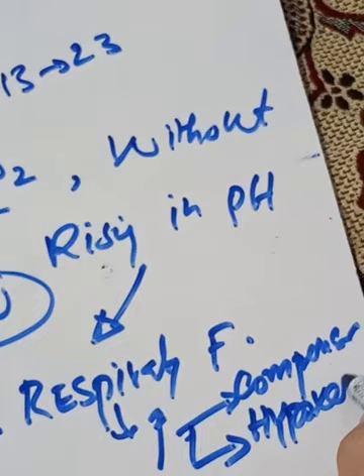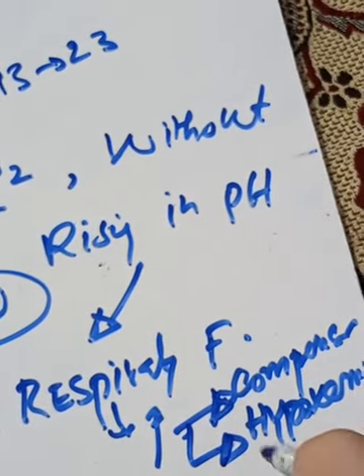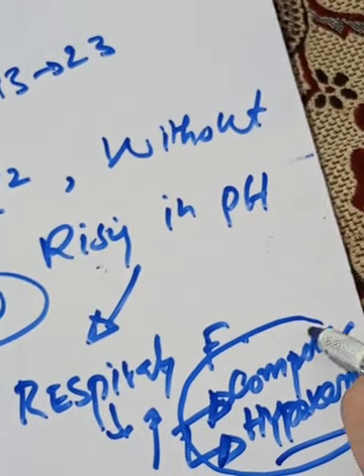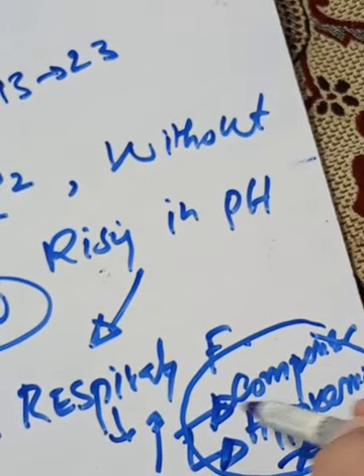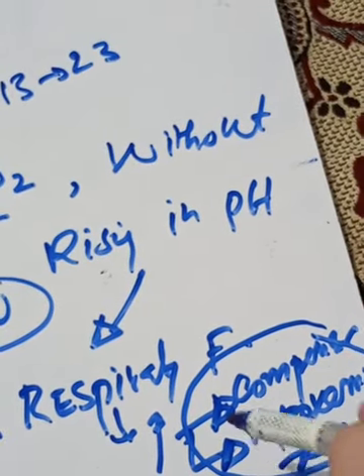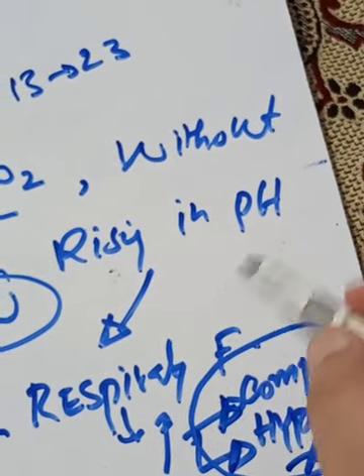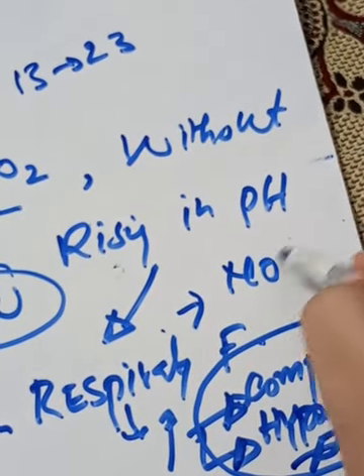To fight the hypoxemia, he will have to take in more oxygen. In order to take in more oxygen, he is washing out the CO2 more. So there is a double stimulus for this, and he also was having pain. So there are three things actually: compensation, hypoxemia, and pain. So this patient was a candidate for a ventilator in ICU, but unfortunately there were no beds.